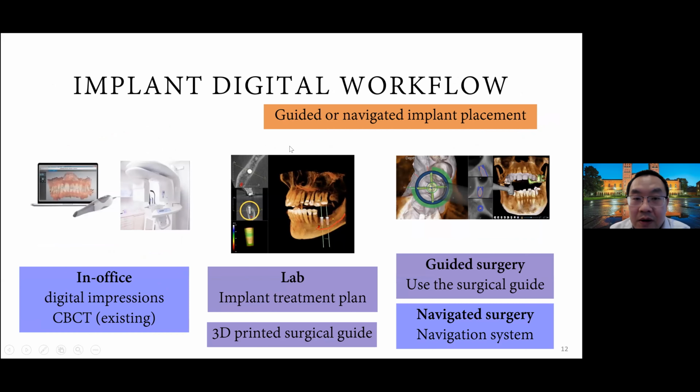We're talking more about implant surgery. So if you're OS or perio, if you're thinking about doing a lot of implants, then there's a guided or navigated implant workflow. Most likely you will need an in-office digital impression, right? And CBCT. And if you're doing this already, most likely you already have a cone beam CT in your office, right?